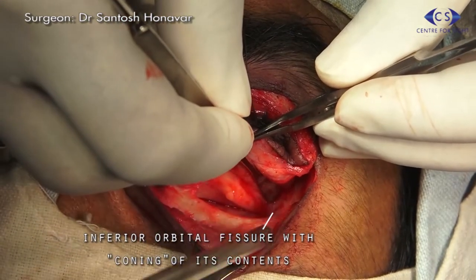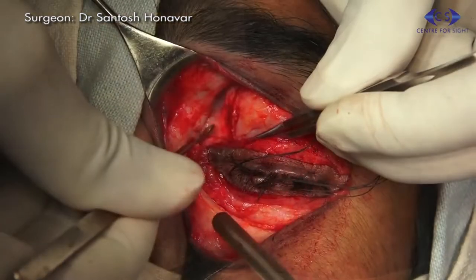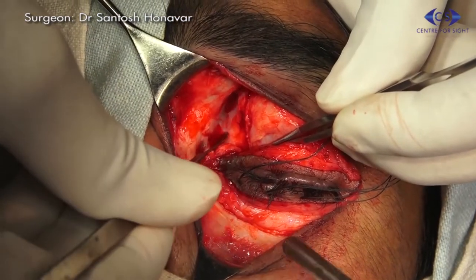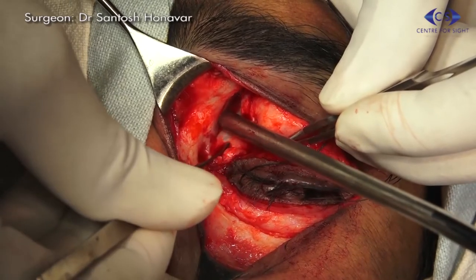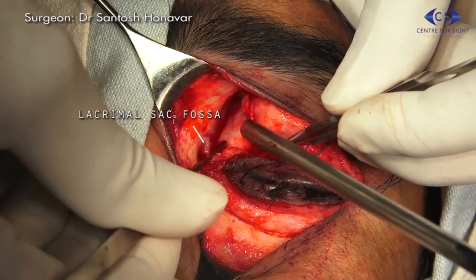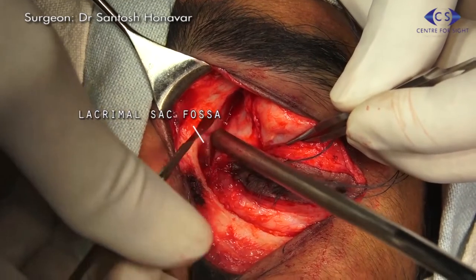The lacrimal sac is approached by dissecting medial to it and dividing the common canaliculus and orbicularis attachments. It is dissected from the lacrimal sac fossa and divided from the nasolacrimal duct with cautery.